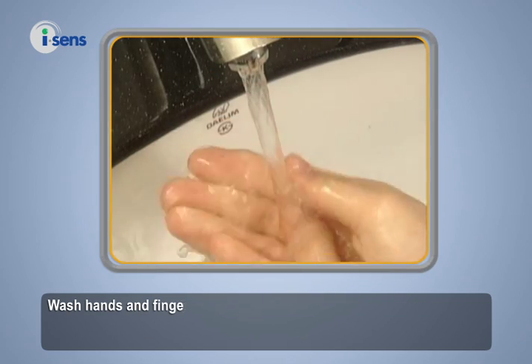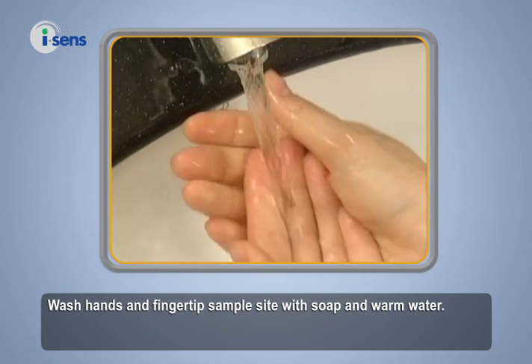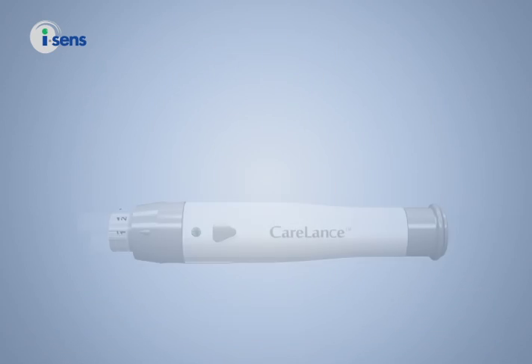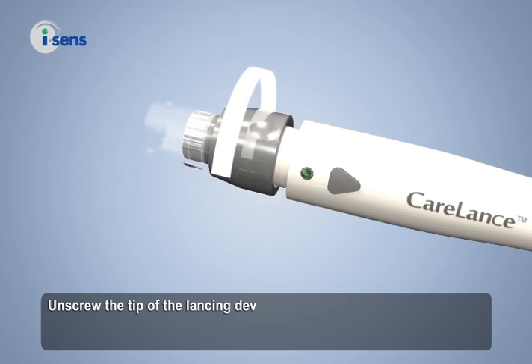Wash hands and fingertips at the sample site with soap and warm water. Rinse and dry thoroughly. Then unscrew the tip of the lancing device.